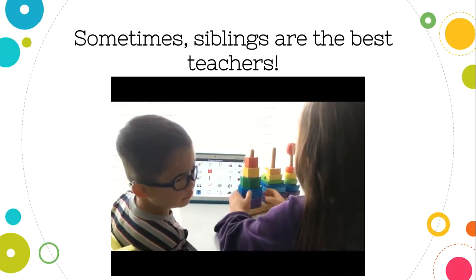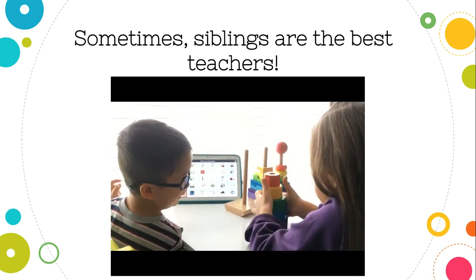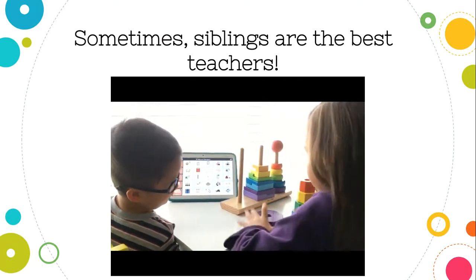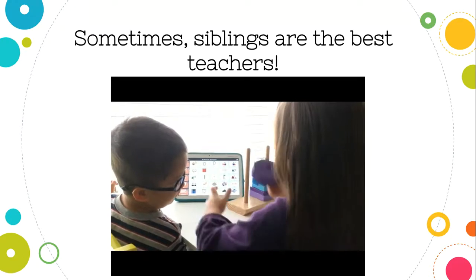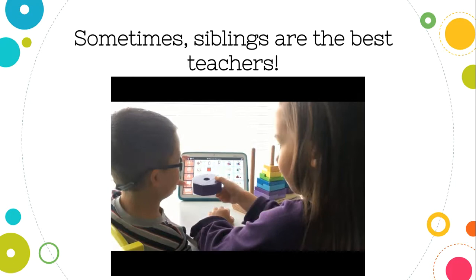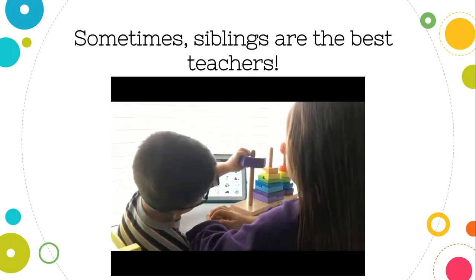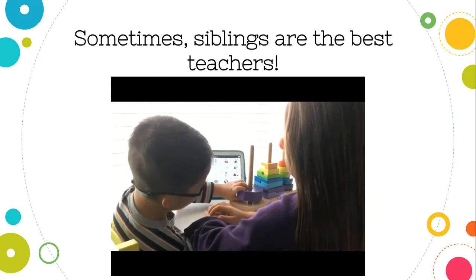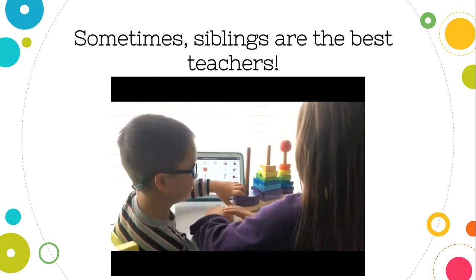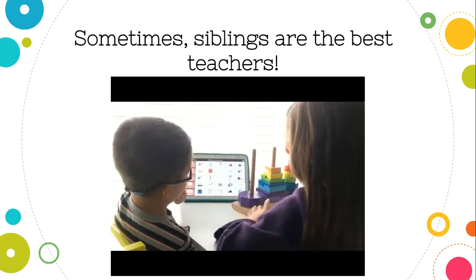Now let's fill them. Let's put purple on the bottom. Can you put it? Now let's put blue on top of the purple one.